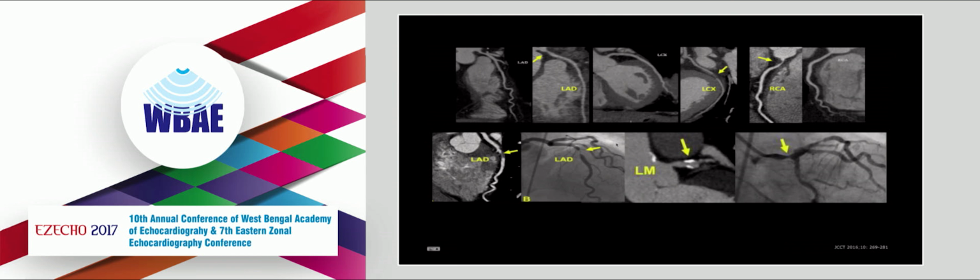So here are some examples of what you can see on CT: a normal LAD, tight proximal LAD lesion, normal circumflex, beautiful pictures, tight circumflex, tight RCA, and a great picture of a left main stenosis which is proven with angiography. You can see how nicely the details correspond to angiography.